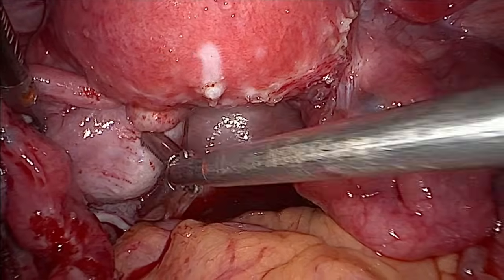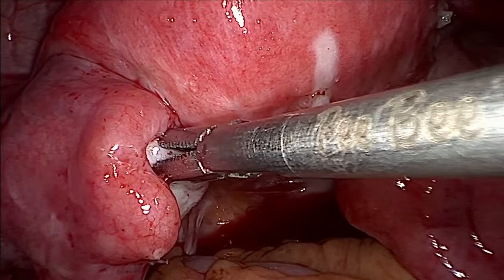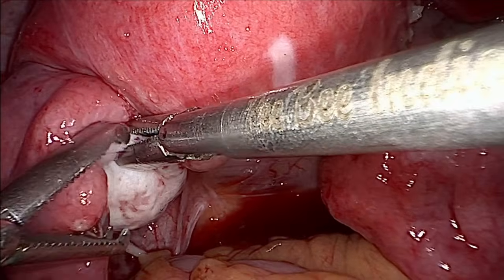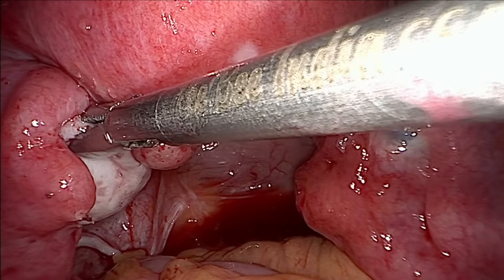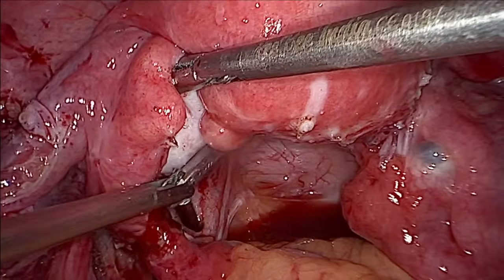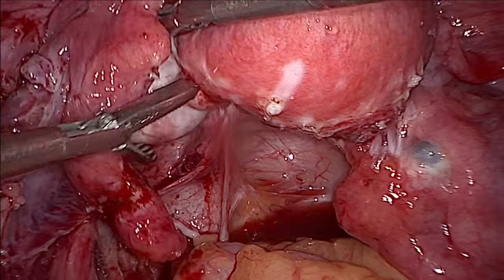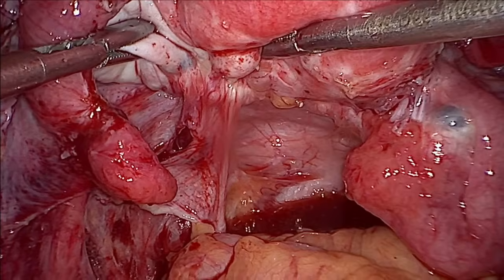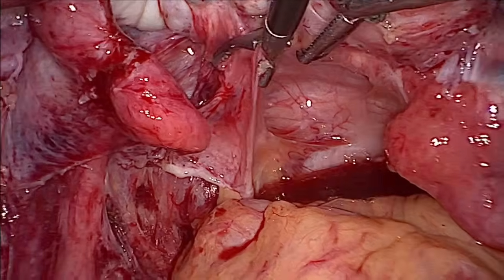Now what Rasik can do, you can come, Rasik, and just lift it up like this. Just a minute, Tanvi, and hold the instrument. The other way you can do is, you can just open your instrument like this and go like this, just keep it like this. Yeah, so now you can see this band of adhesion.